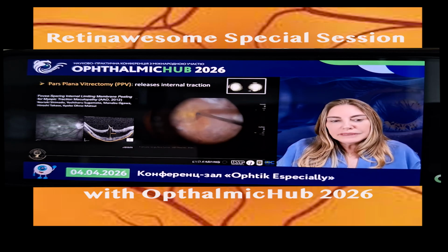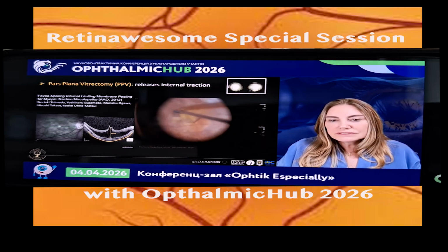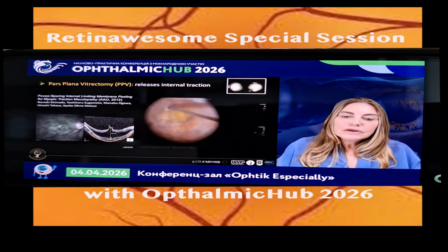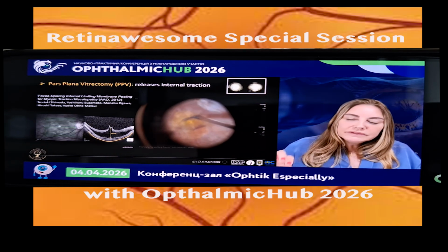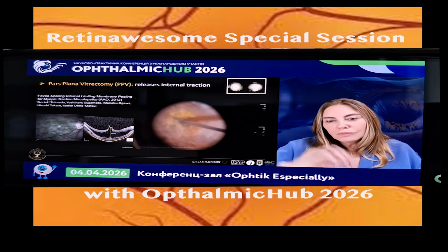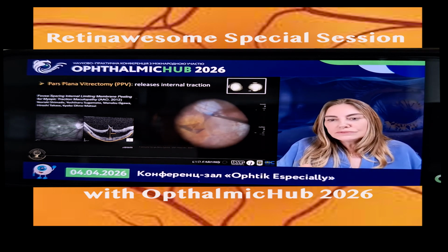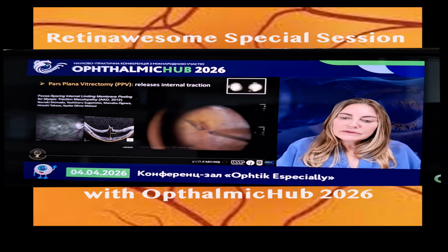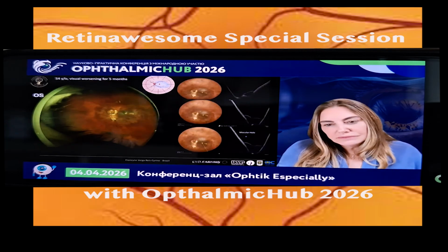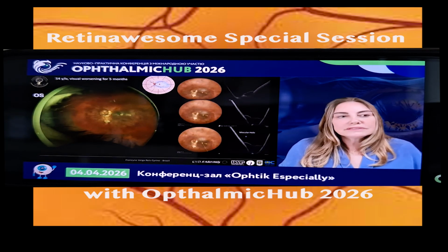If you may create a full thickness macular hole during the surgery, you should think about leaving the ILM over the fovea, not to open a macular hole. So what you do is remove the ILM and leave it over the fovea, and then do air fluid exchange gas.